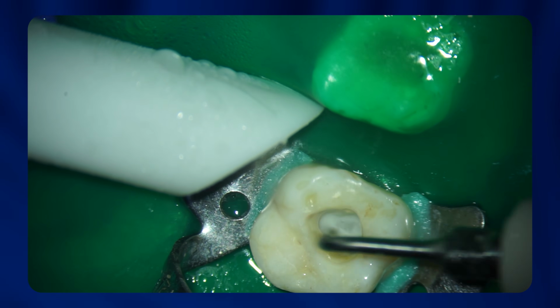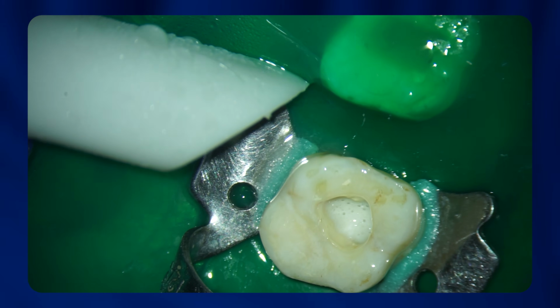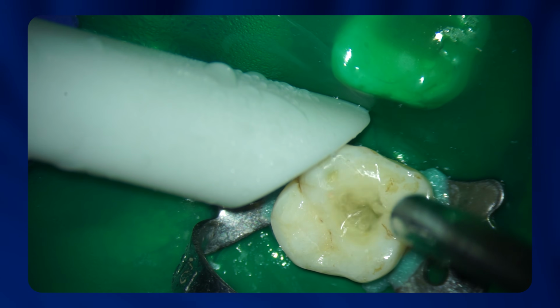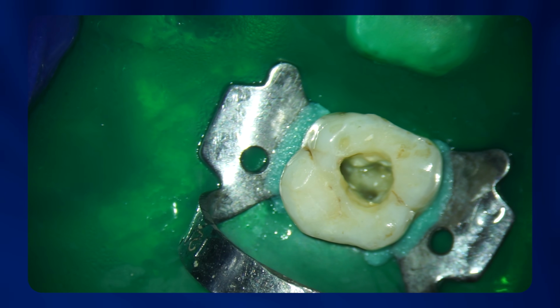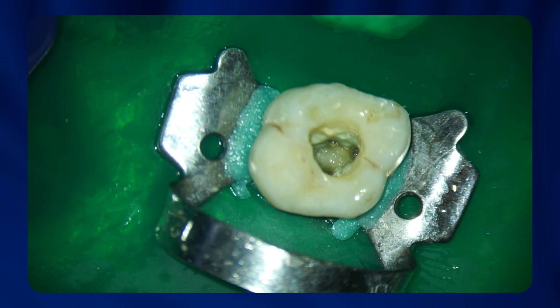And then of course, the calcium hydroxide in the canal coronally is removed a little bit with ultrasonic. The calcium hydroxide in the canal is easily rinsed out with water from an irrigation syringe, and this can be followed up with EDTA and K-files to remove whatever residual calcium hydroxide is there in the canal.